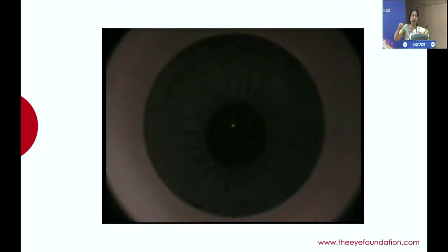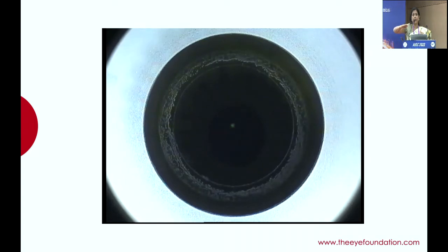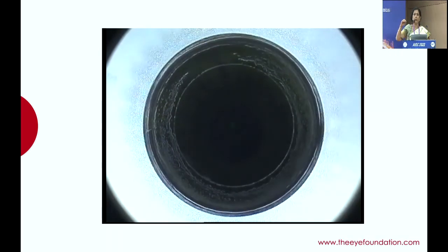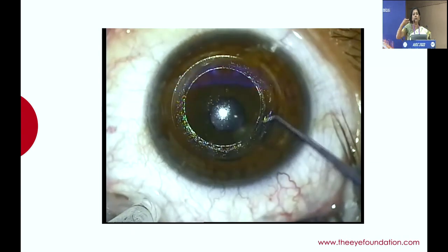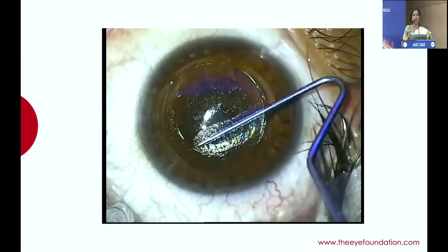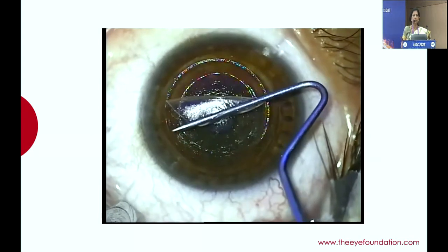How you go about it is you first create a lamellar ring in the dimension of a flap cut, and then once the ring is created, you would lift up the flap. The ways are either you could create a pocket above the ring, above the flap to be created, or below, or on the same level. But the D approach has been found to be the best approach, wherein you create the lamellar ring at the same level as the primary surgical procedure. And then this is the way you would lift the flap.